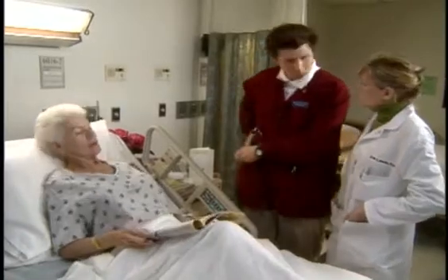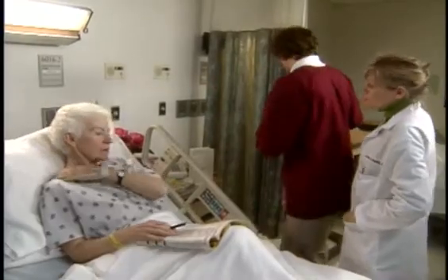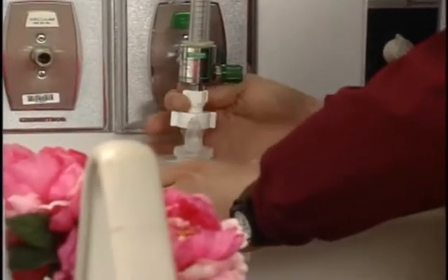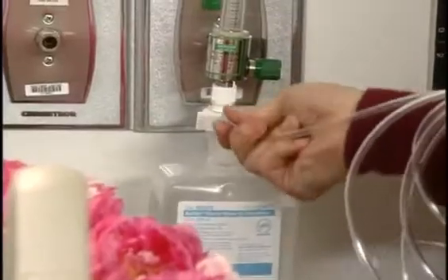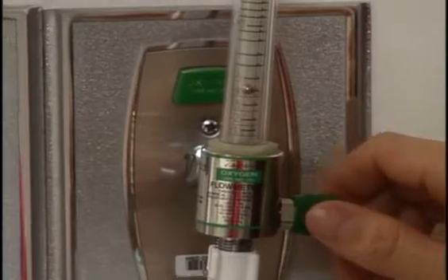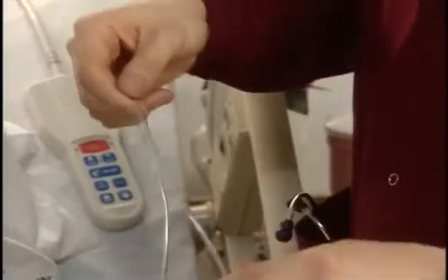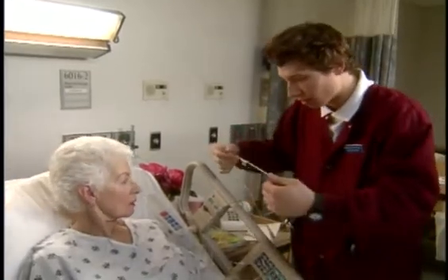Okay, you can sit back down now. Now I'm just going to hook up the humidifier and connect the nasal cannula to the oxygen source and flow meter. Great. Now adjust the flow rate to the ordered amount, 4 liters per minute. And now I'll just check for adequate flow. Feels good.